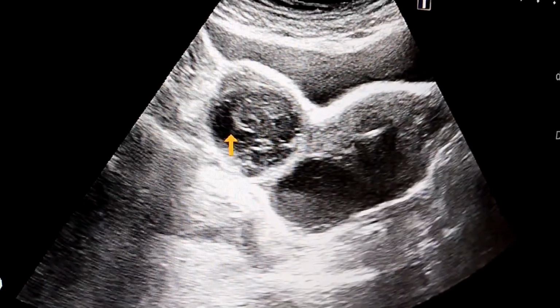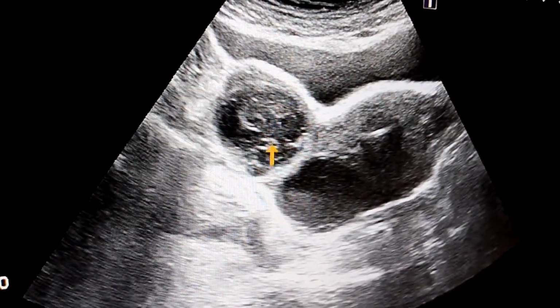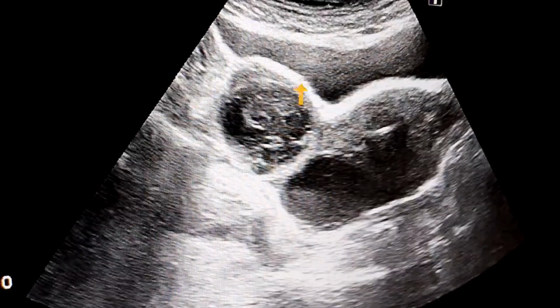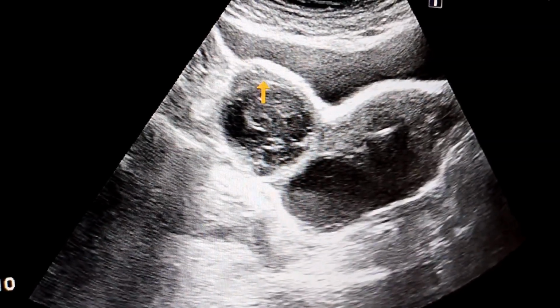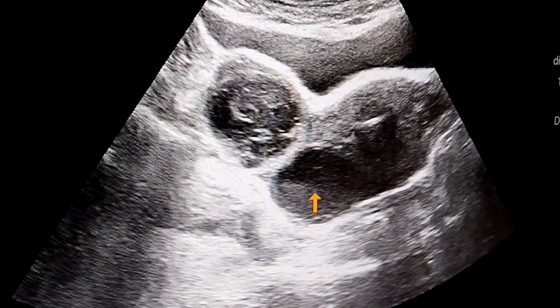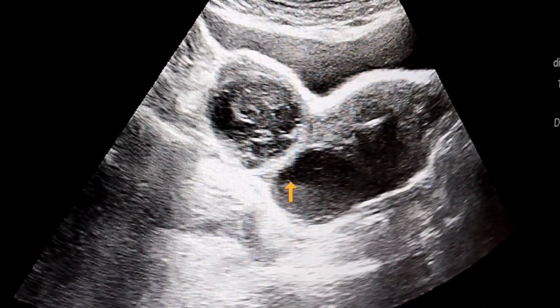So what we have seen, number one, the echogenic linear strands, we call it echogenic dot line, then internal echoes, well defined cystic lesion, and also the cyst has thick walls. And in the second cyst, we can appreciate the fluid debris level, and the wall is not too much thick.